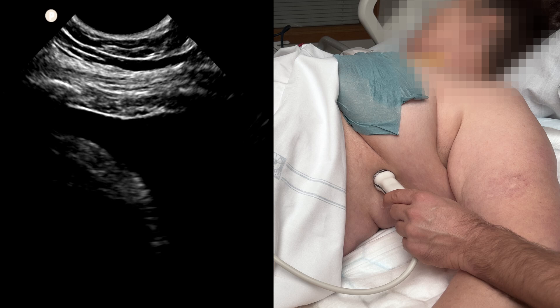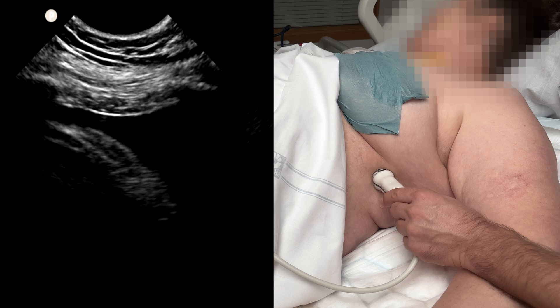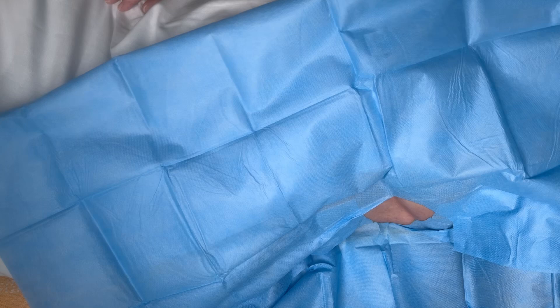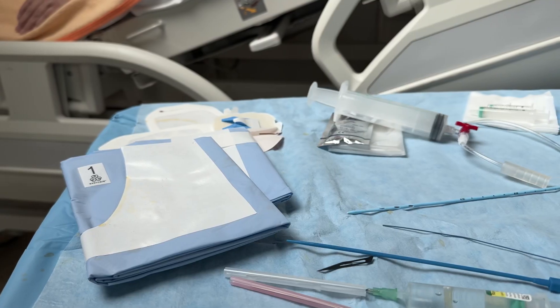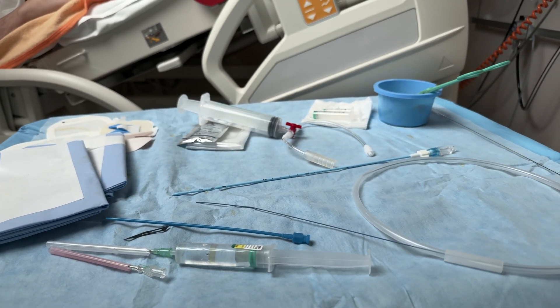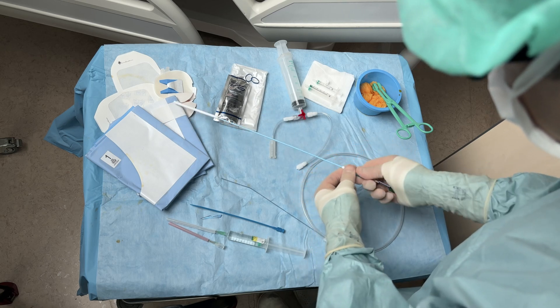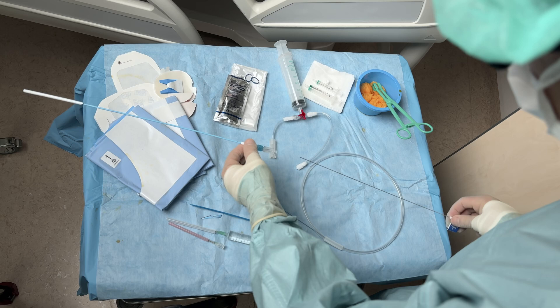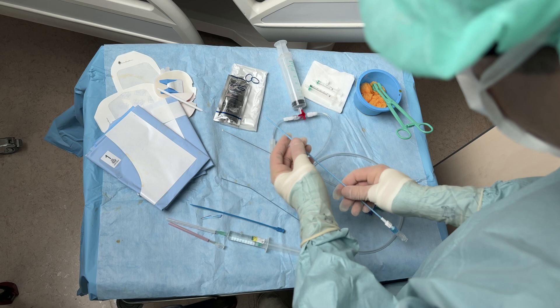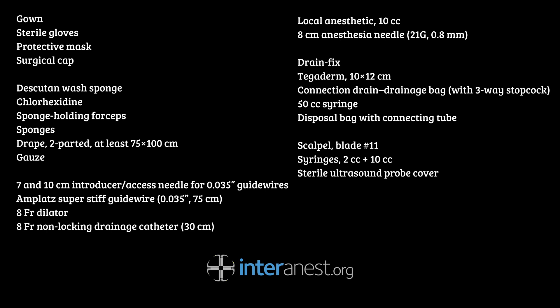It's possible to use a linear probe, but the small footprint and depth penetration of the microconvex are superior for this technique. Prep and drape, and make sure you have sufficient margins around the puncture site. Now prepare your tray. Here's our custom set with a 30 cm non-locking 8 French pigtail drain. Prepare it by straightening the pigtail and locking the metal stiffener. Remove the sharp tip central skewer — this is only used for the one-step approach. Use a super stiff guide wire that prevents kinking, and prepare it so it's ready for rapid insertion. Here's a list of suggested equipment.